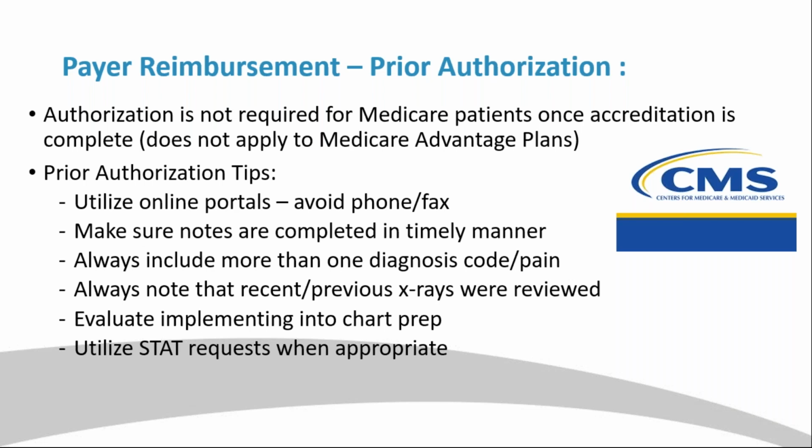You always want to note that recent or previous x-rays were reviewed. So you want to make sure that you speak to any recent imaging that you've looked at and acknowledge that it was not sufficient to make a diagnosis or determine whether additional interventions were required.